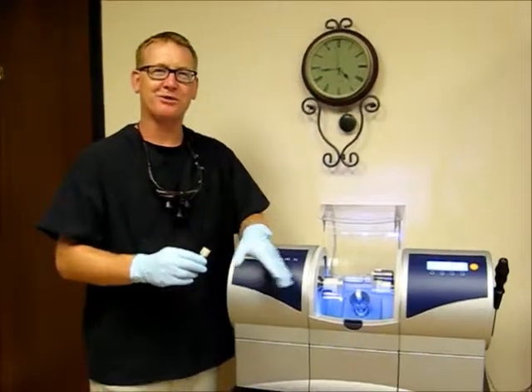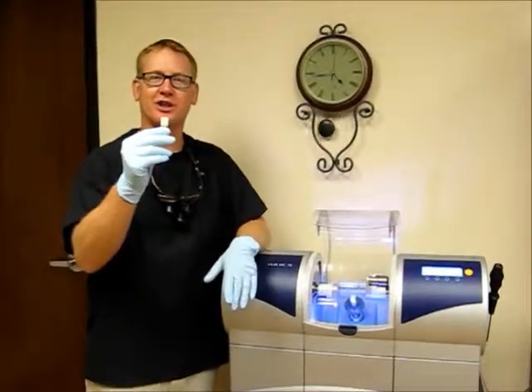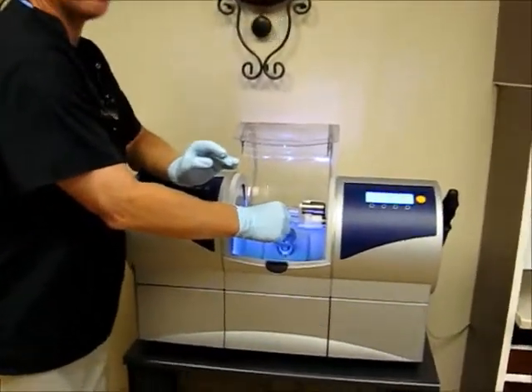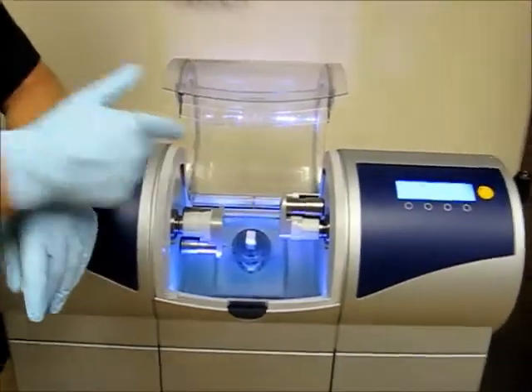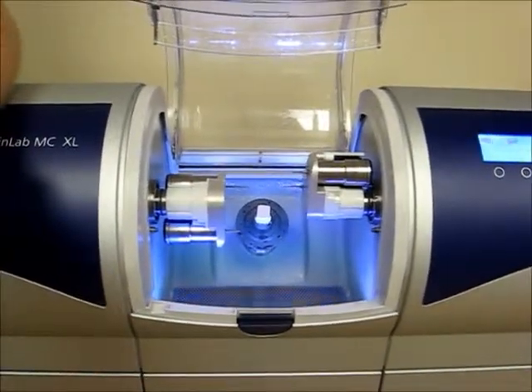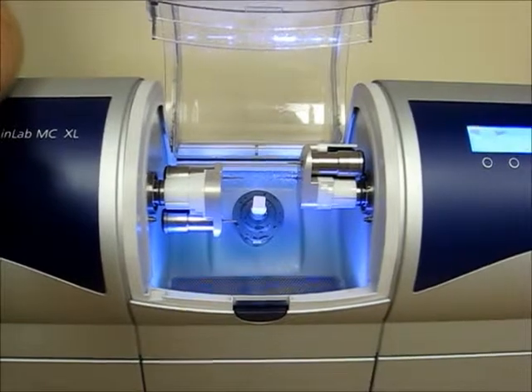Here's our milling machine, and here's a block of porcelain that we're going to use to mill your crown out of. We take the solid block of porcelain and put it in our milling machine. The milling machine has diamond burrs that actually mill your crown right out of that solid block of porcelain. You can even watch your crown being made while you're here.